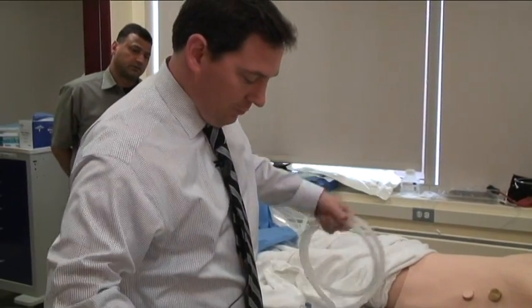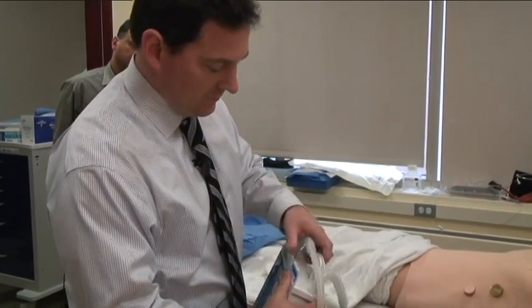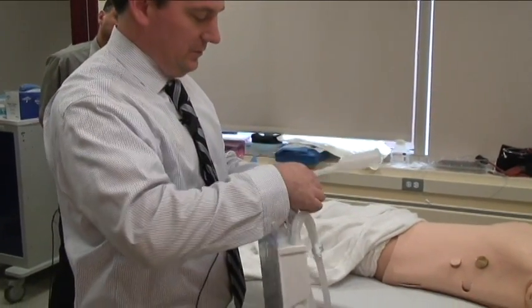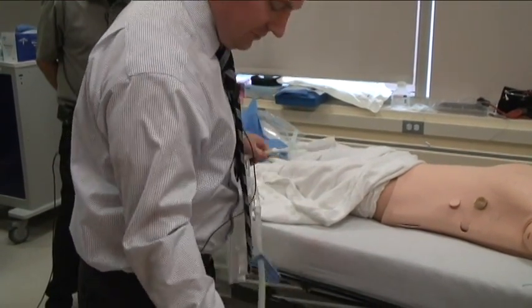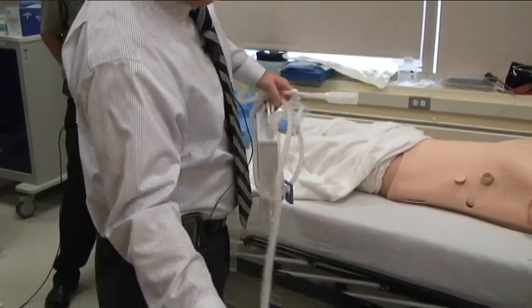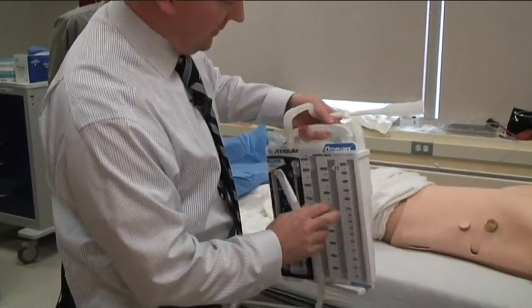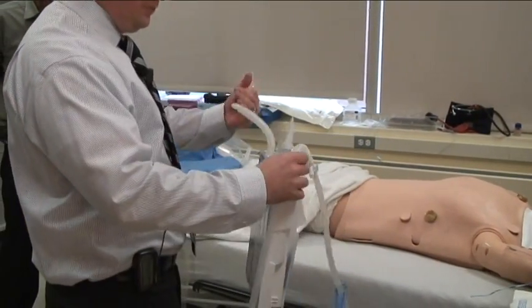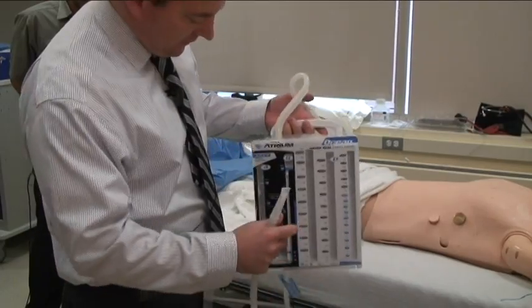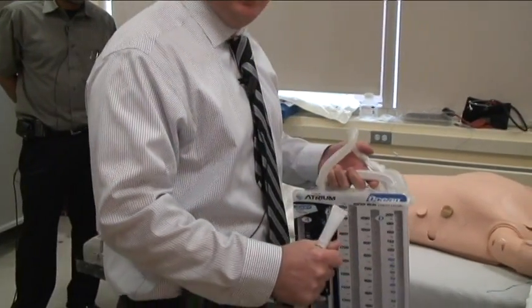So what you can do is open this up, make sure everything works. You'll make sure that these valves are able to spin, which they are. And this is the patient end. It has a sterile connector that will ultimately attach to the chest tube and drain into the collection chamber. So first things first, we need to fill this with water. Generally, you prefer to use sterile water as opposed to normal saline because the salt, as the water evaporates, may accumulate and gunk up your device.